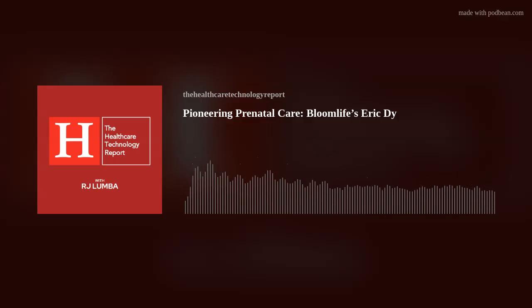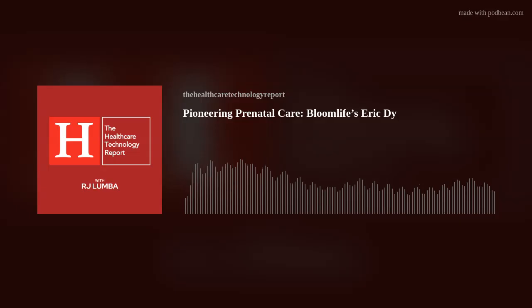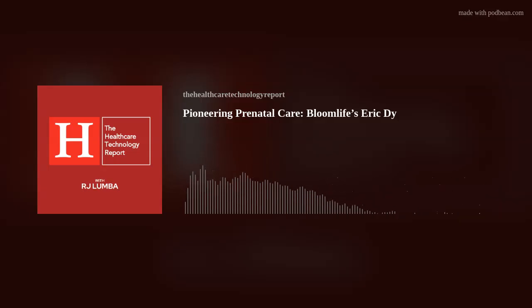On the fetal monitoring solution, the FDA is very clear: they want the data to be reviewed by the provider before the mom does anything. So that data is sent to the clinical teams. They do the normal interpretation of the data, and then they'll notify the patient if there's anything else to be done. At some point, I think there's definitely an opportunity to use some of these AI algorithms to do some of the initial interpretation, but that's a later thing that we'll work on.